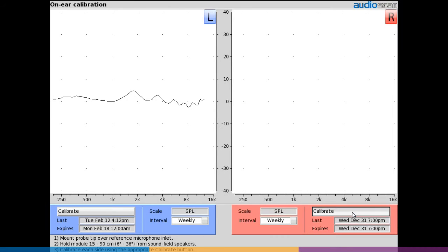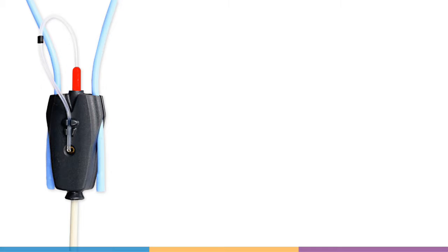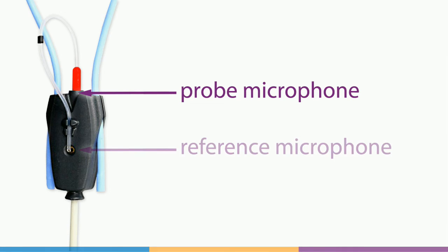The probe microphone coupled with the silicone probe tube does not have a flat frequency response. The user calibration process compares this response with the flat factory-calibrated response of the reference microphone and compensates all subsequent probe tube measurements for this difference.